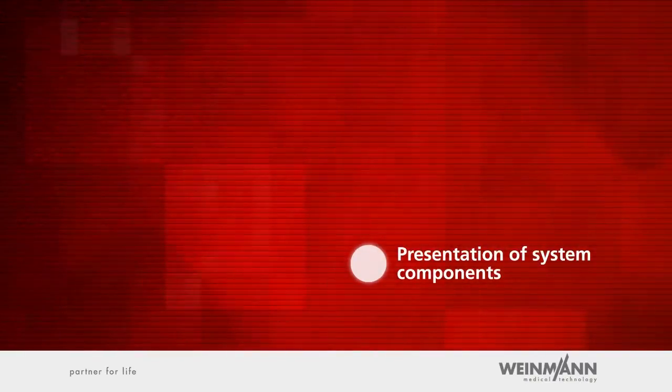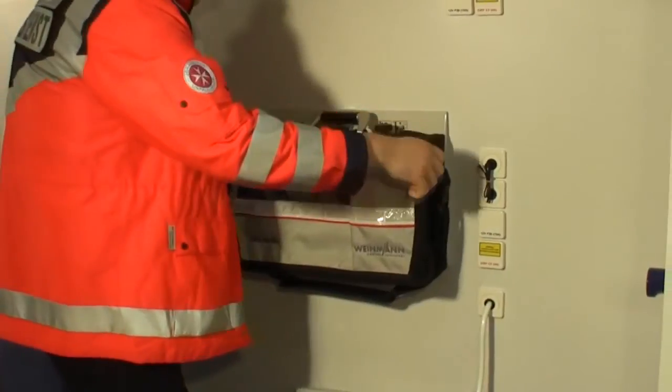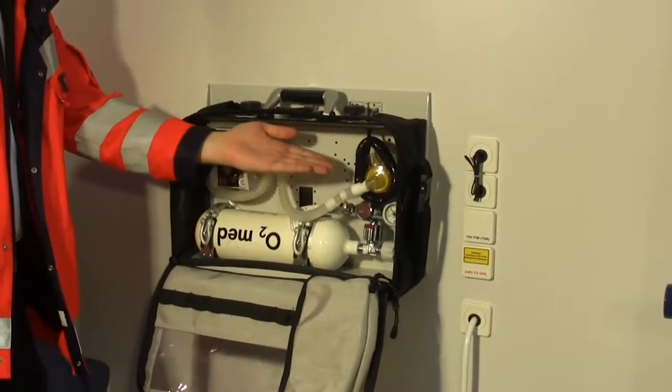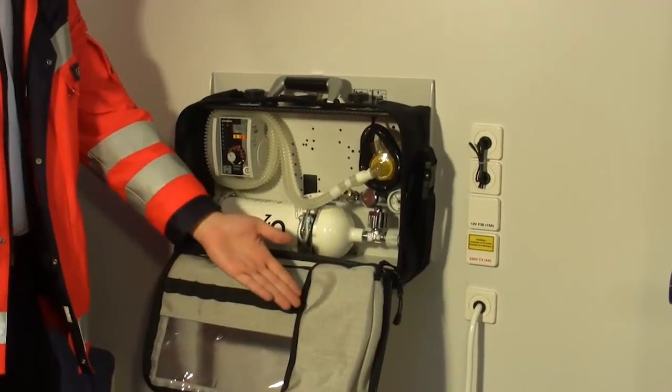Presentation of system components. The protective bag surrounds the portable system LifeBase 3 and protects the medical products on it from environmental damage caused by dust, rain and snow. The main compartment on the front can be opened completely by unzipping the zipper. With the compartment open, the user can operate all the medical products installed on the LifeBase 3 and can reach the interior storage bag which holds accessories.